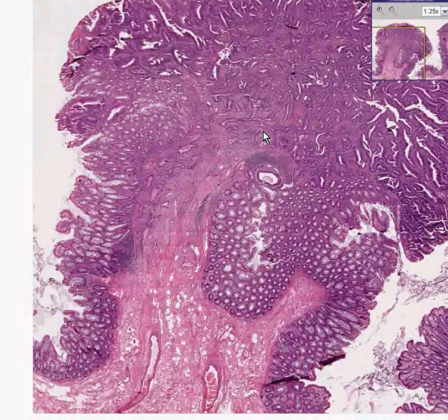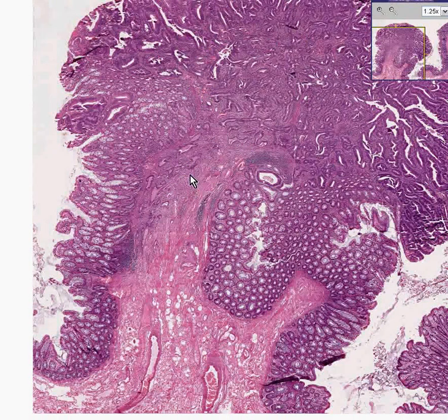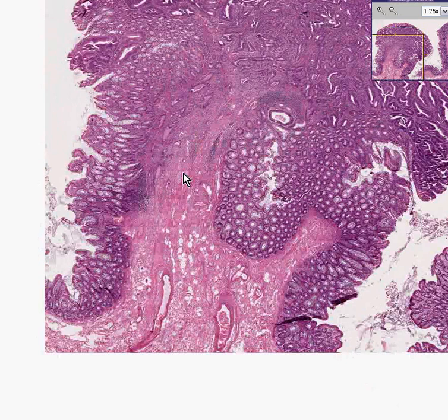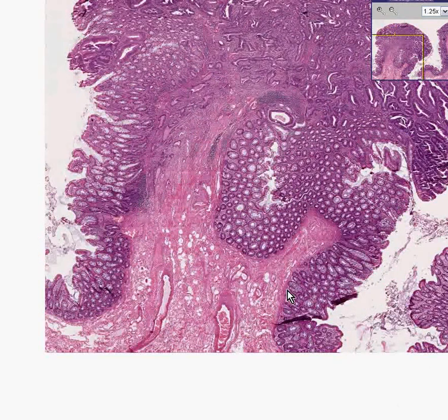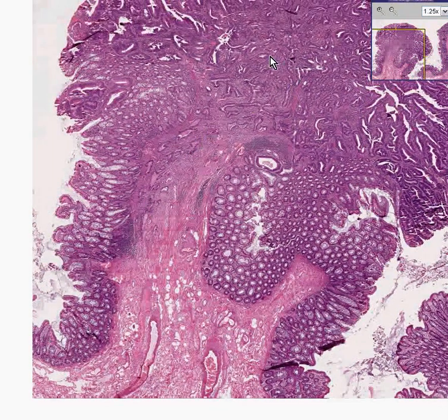Once any tumor infiltrates into the stalk and beyond the muscularis mucosa, it then runs the risk of being a potentially metastasizable tumor. And whereas if you were to examine this part of the stalk or cut this part, you might tell the surgeon, oh, don't worry, the stalk is okay. Well, maybe the edge of the stalk is okay, but there are glands out here and out here in which cancer has invaded the stalk.